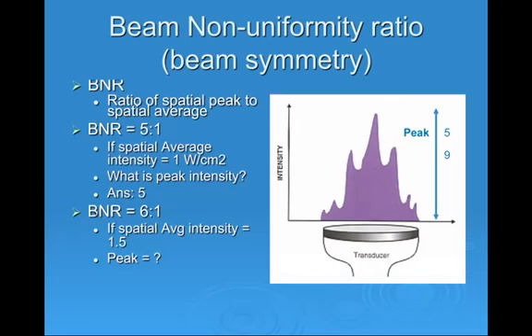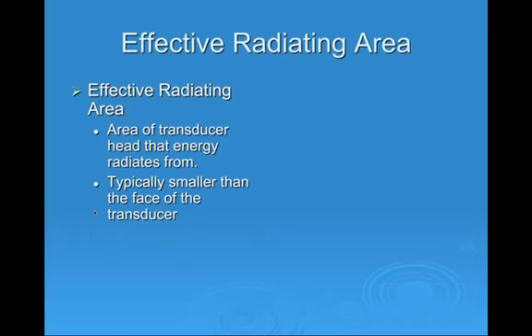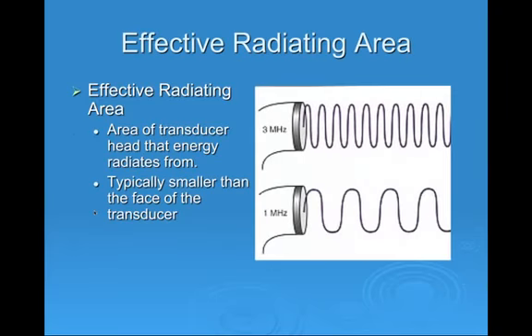Okay, so that's just the FDA requirement. You don't really know what your BNR is. But the better the crystal, the lower the BNR is going to be, and you're going to have an easier time giving a treatment to someone, not have to move the sound head quite as fast.